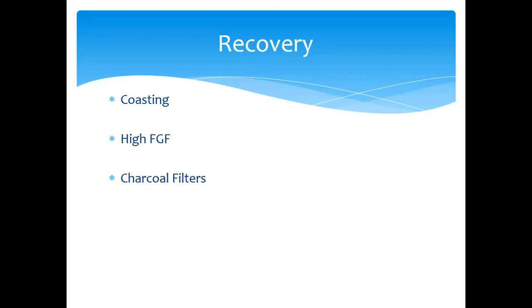So what we do is keep the gas flow at low flow levels, 500 mL, 1000 mL, whatever we are using, but we switch off our vaporizer some 15 minutes before and allow it to coast down. Slowly, slowly, the MAC levels will decrease to a level where the patient will start to wake up. The other technique is that we change our vaporizer level about 5 minutes before the end of surgery, then close off our vaporizers and increase our fresh gas flows, because of which our time constants will also decrease, and we allow a quick washout of the volatile anesthetics, and this quick washout will allow our patients to wake up quickly.